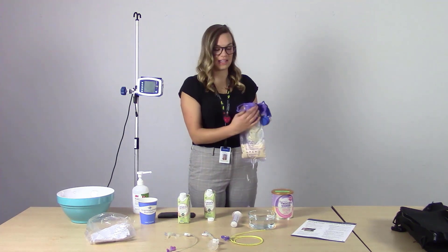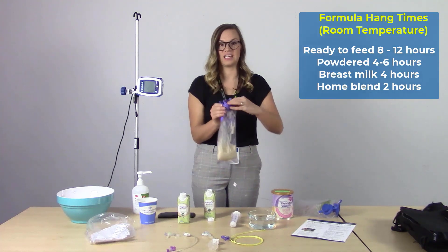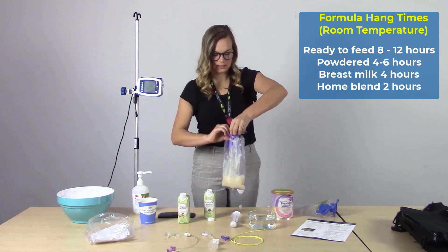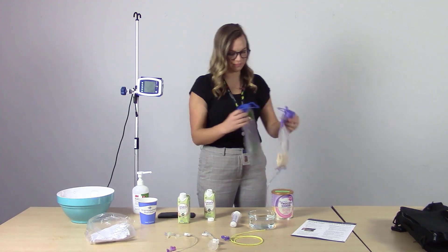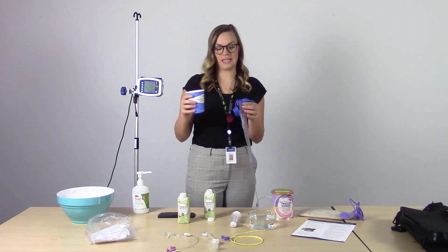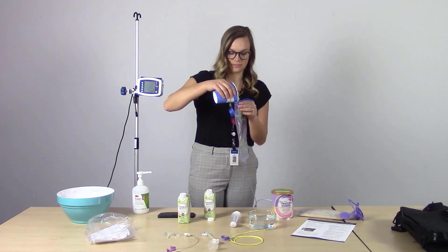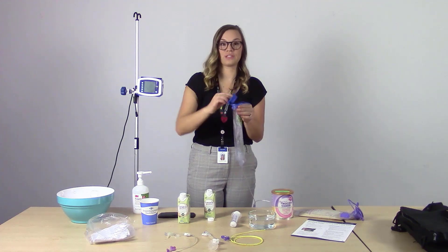Next, we'll take the cap and close it by pressing down where it says 'press here' with two fingers. Next, we'll fill the flush bag — take the water and fill the flush bag, then press with two fingers to close.